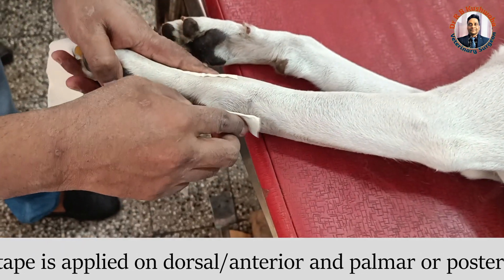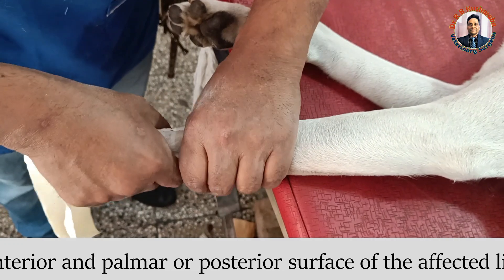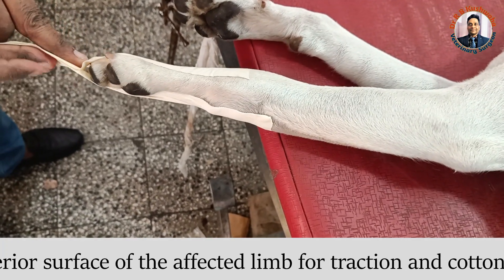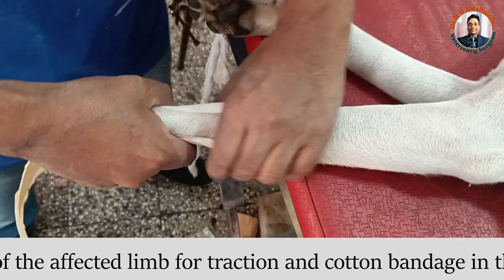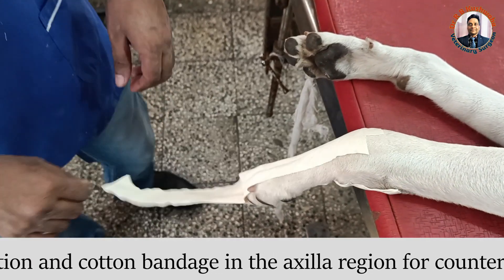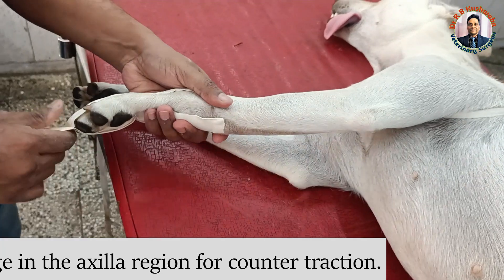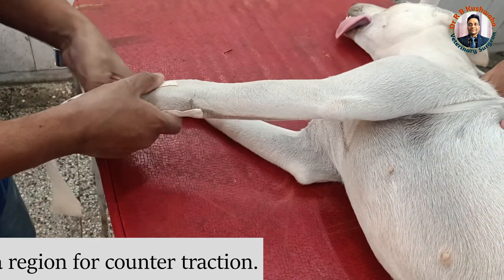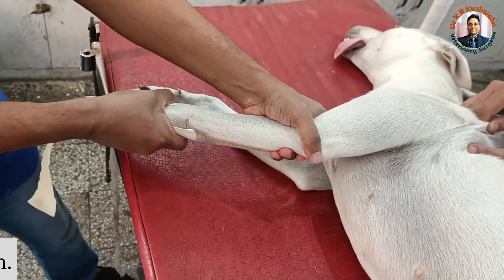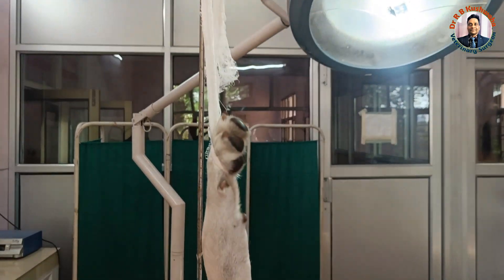This is a one-day-old fracture. In case of a fresh fracture, reduction by external method can be done; otherwise in old cases it is very difficult to reduce. I have applied the tape — one assistant will pull like this — and then there is one bandage under the axilla. This one is for traction and this is the counter-traction. Now the next step is to try to pull.